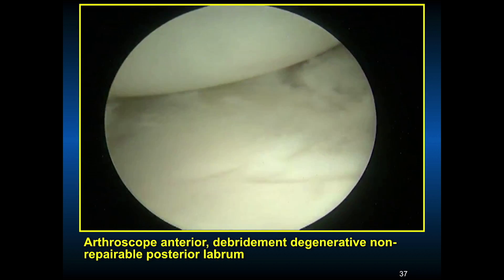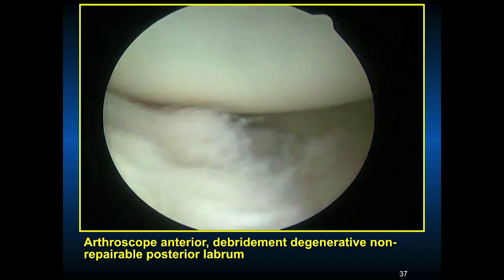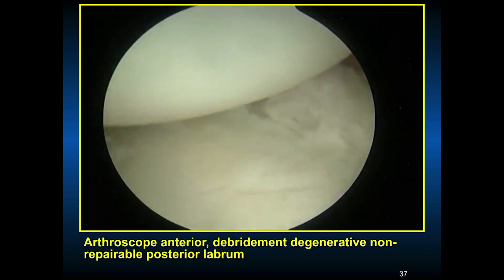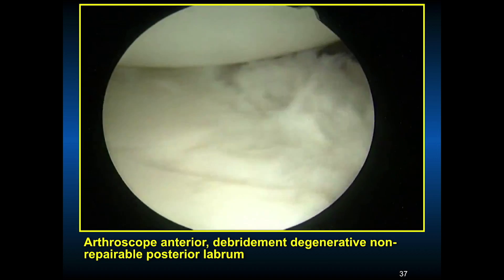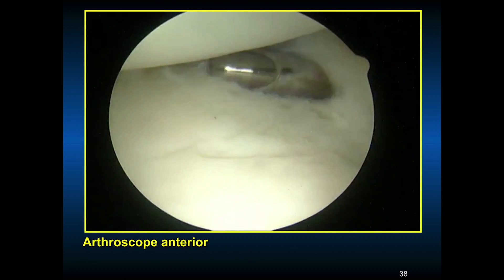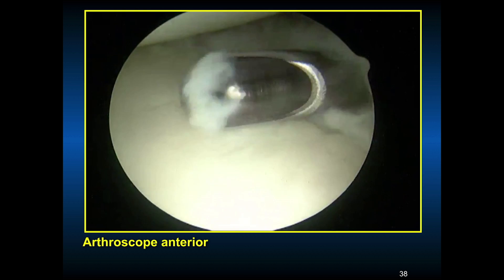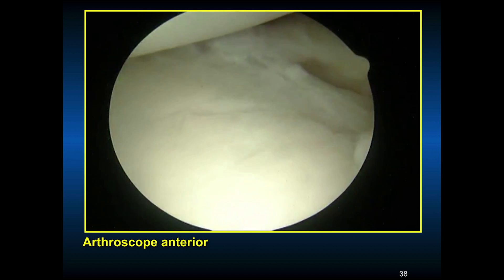With the scope anterior, you can see that degenerative tissue in the back. We couldn't really do any posterior inferior repair, so a debridement of that posterior labrum was done, putting the scope in the front and the working portal in the back. With the scope in the front again, you can see how degenerative and non-repairable that tissue is — it's not the best tissue in the posterior aspect.